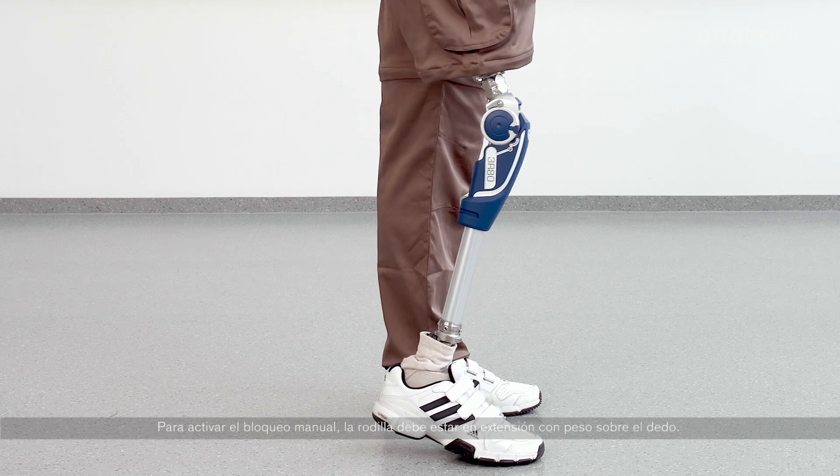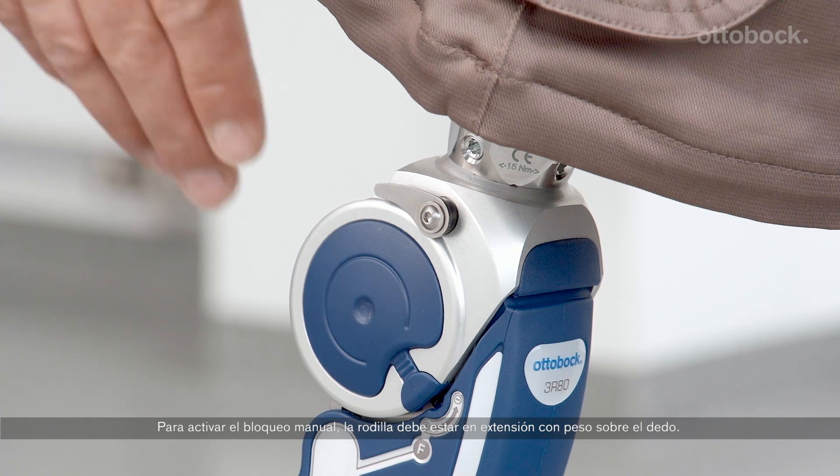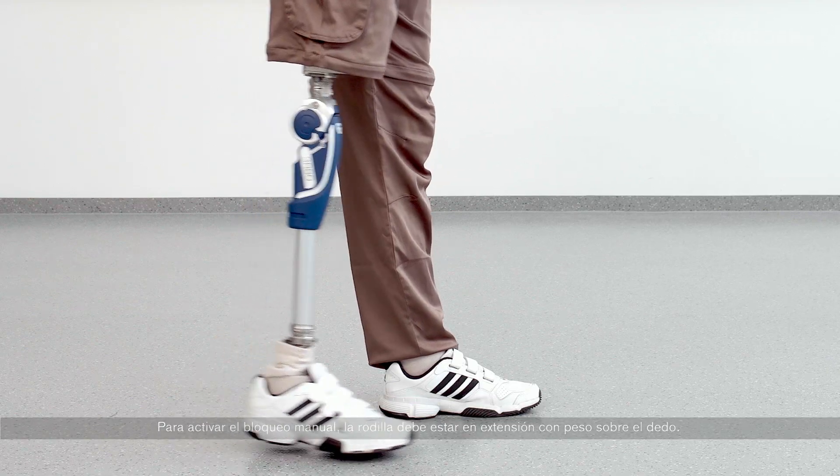To engage the manual lock, the knee must be in full extension with weight through the toe. Once loaded, push the lock lever down. Verify that the knee is locked.